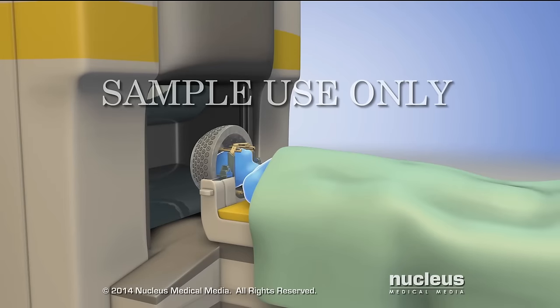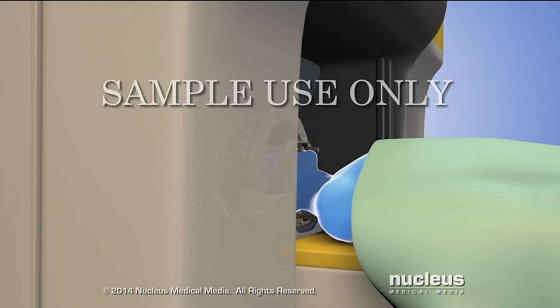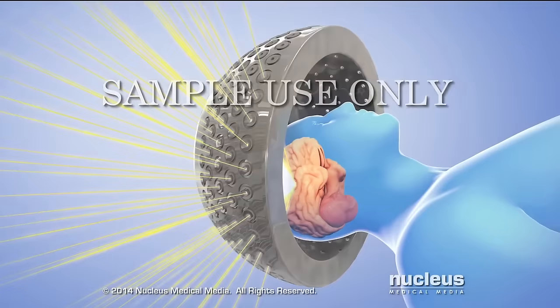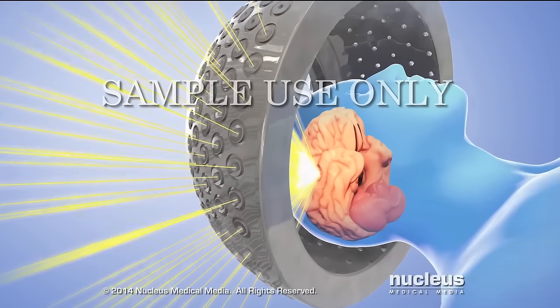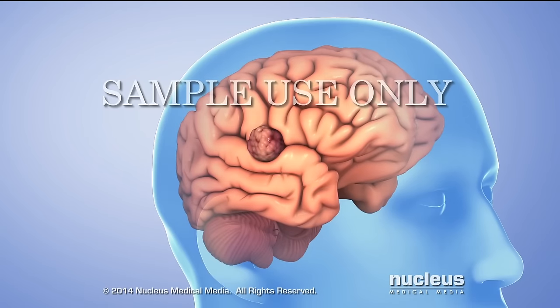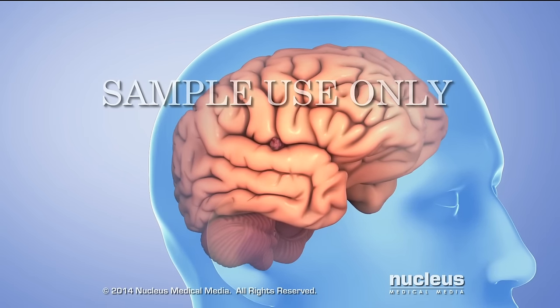The procedure is silent and painless. It takes a few minutes to an hour or more, depending on the size and shape of the treatment area. The effects on the tumor occur over a period of time after the procedure.